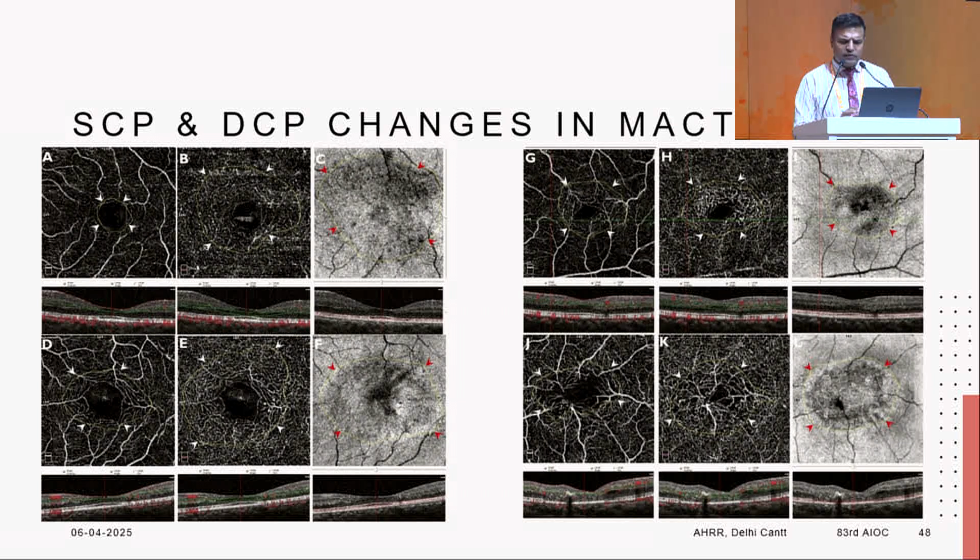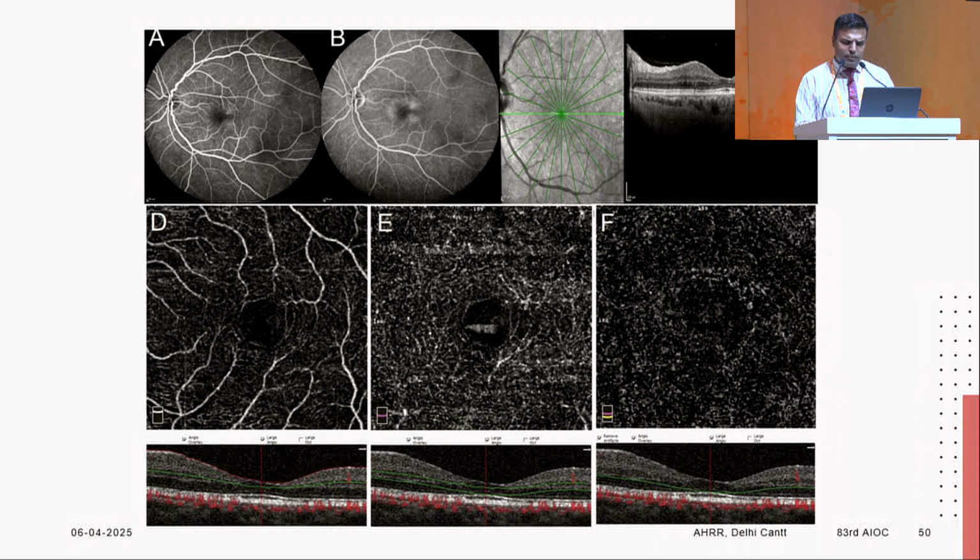then they progress to a complete disruption of the deep capillary plexus as the disease progresses, with fibrosis and development of pigments. This is another example where we can see that there is a complete disruption of the deep capillary plexus as the disease progresses, and in image E you can see multiple telangiectasias present on the temporal part of this fovea.